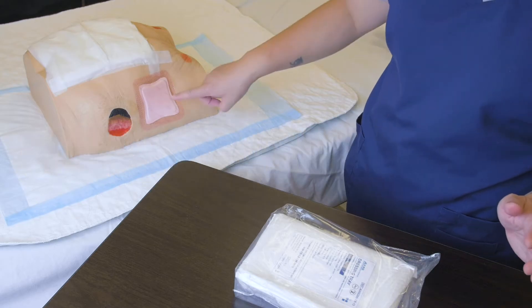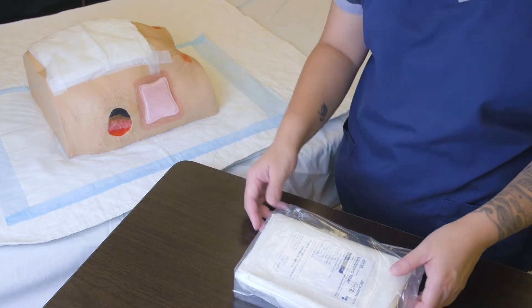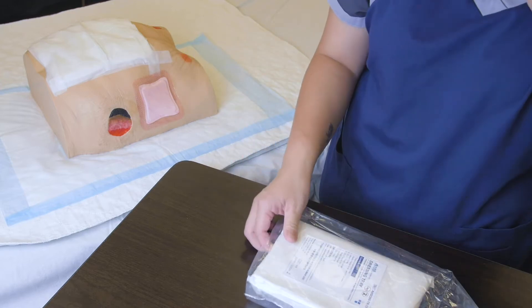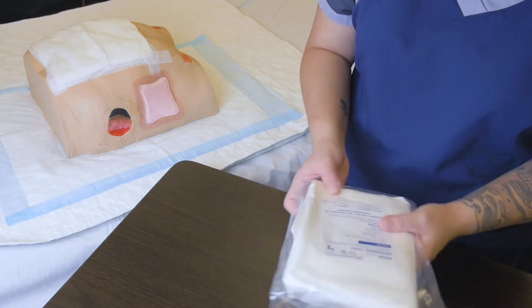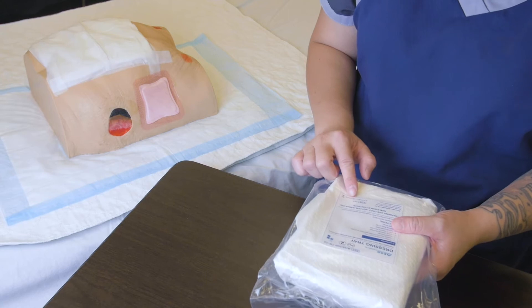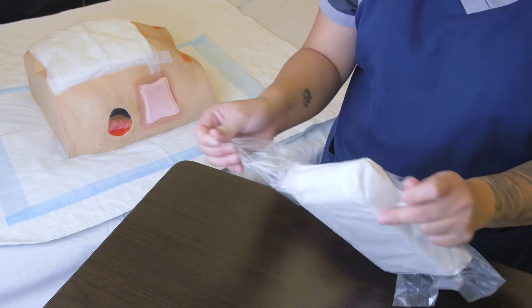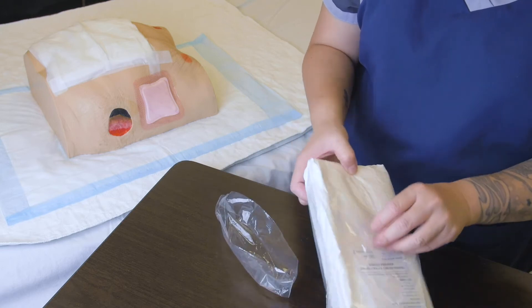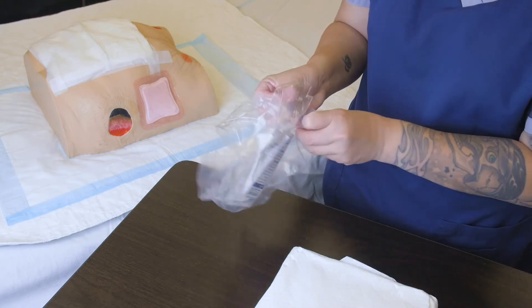Hi everyone, today we're going to change the dressing on this patient's left hip, which is covered by an Allevyn dressing. First, we want to make sure that our package is intact. We check the expiry date on the kit and open it on the perforated edge, just to make it easier. We remove the outer packaging and throw that into the garbage.